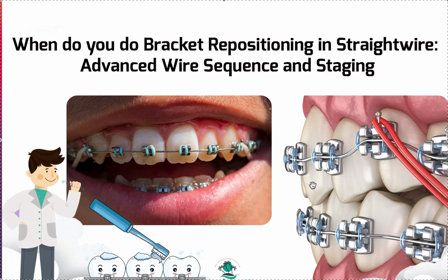we've done that at this point. That's what we've done already. We're not going to go back and move brackets around again. So if there's some tooth you just think isn't quite the way you want it, and there's a lot of art that goes into orthodontics, it's not just a science, it's also an art. So it's not wrong if you want to move those centrals up 0.5 millimeter. It's not wrong if you want to move those canines down 0.5 millimeter.